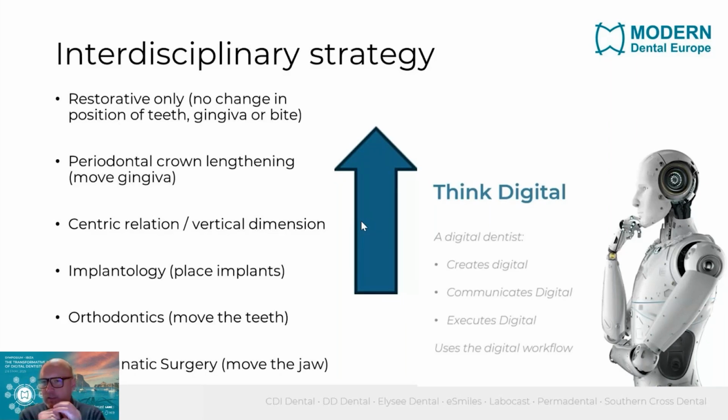And it's not because we think digital today that we can forget this workflow. Often we see cases where implants are already placed, and then the question comes: can we start an aligner treatment here? So it's the other way around. We really need to follow this strategy, and digital tools help us to show the patient, to convince the patient, also in these multidisciplinary, combined treatment cases.